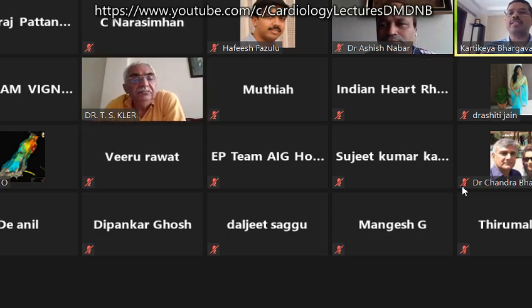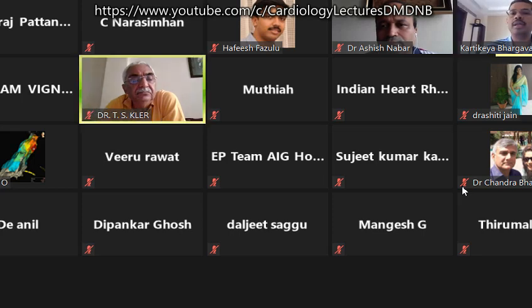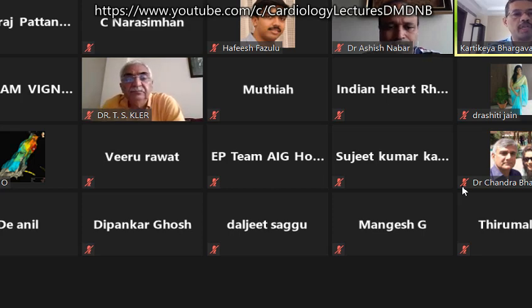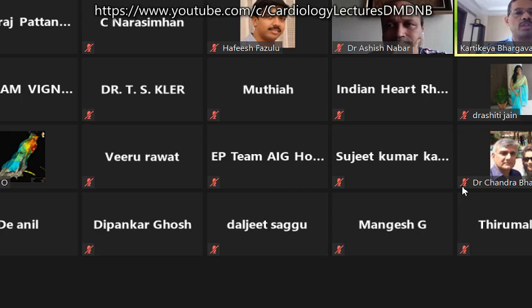Yeah, so next is the ideal site for ablation of a fascicular VT. Now again, in fascicular VT the reentrant circuit has been very well defined, but there are a lot of variations in the reentrant circuit. And typically what we believe is there are different approaches to ablation, but the best approach is looking at the potentials. Now in the reentrant circuit, if you are at the target site, you will see a pre-potential and a Purkinje potential just before the onset of the QRS.